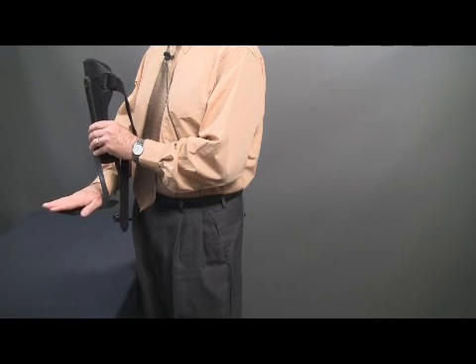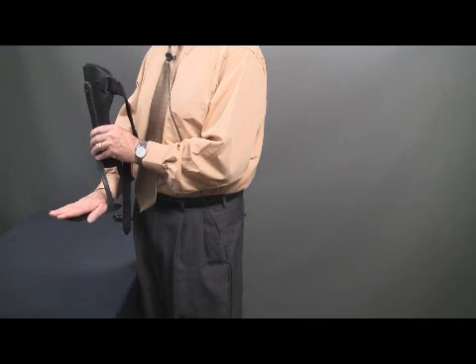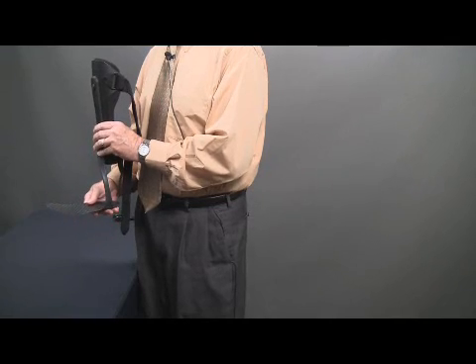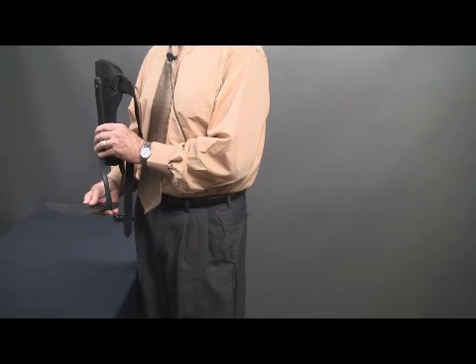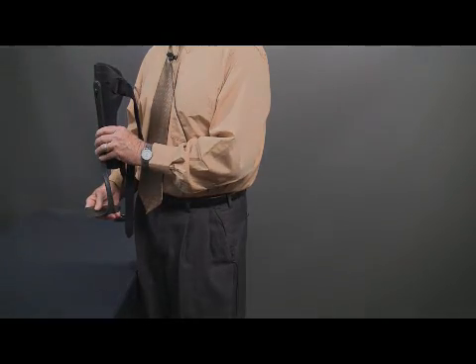Some practitioners and some therapists tend to glue down the inner sole on top of it, but you don't have to, because a lot of times patients like to change them from shoe to shoe. That again is a benefit of having this type of carbon fiber AFO. You can change them from shoe to shoe. You don't need to stick with one pair of shoes.